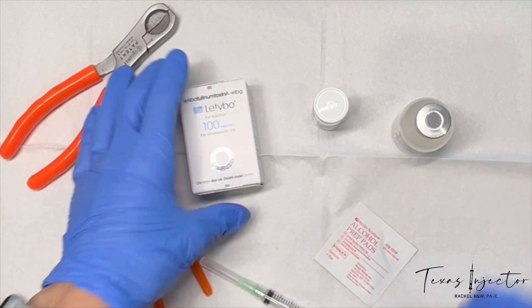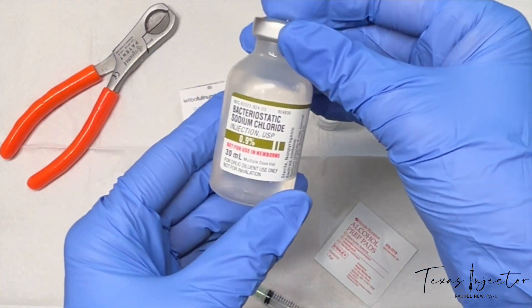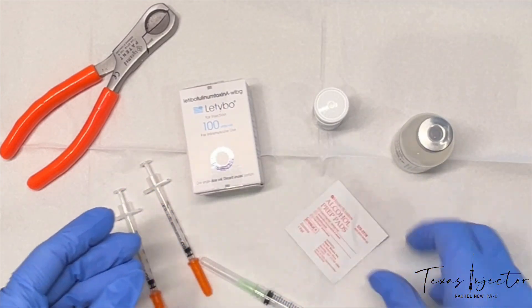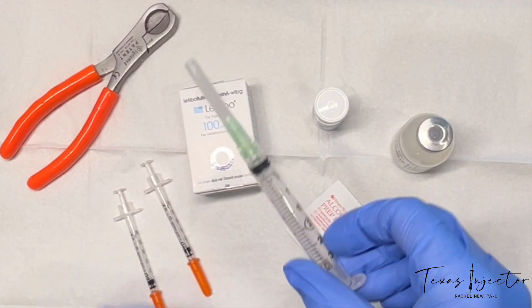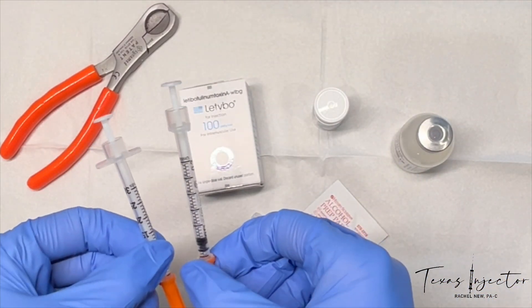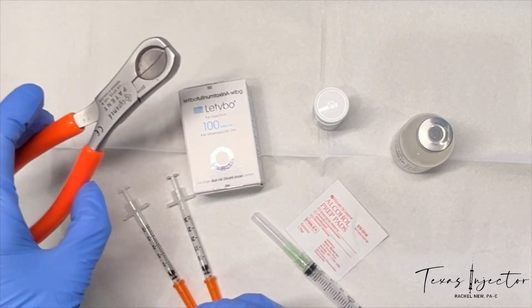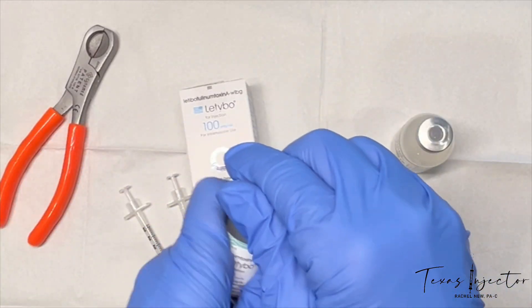What you'll need to blend is your bacteriostatic sodium chloride, an alcohol wipe, a 3 ml syringe, your insulin syringes, and something to take the lid off. Let's get started.